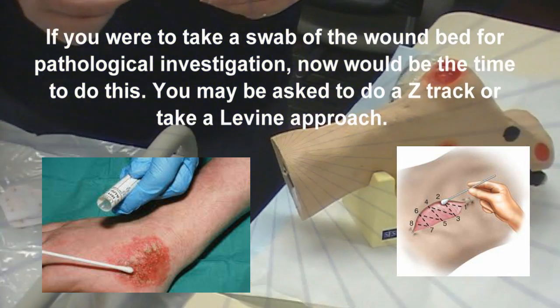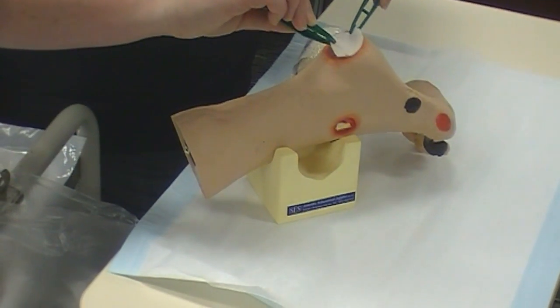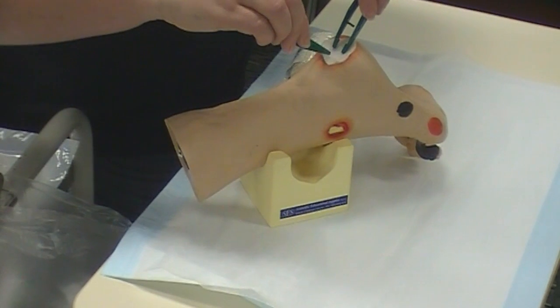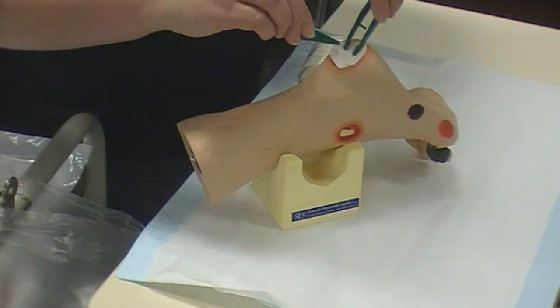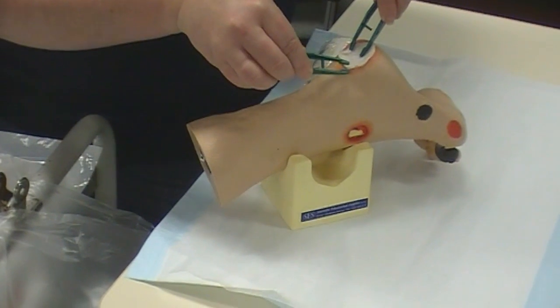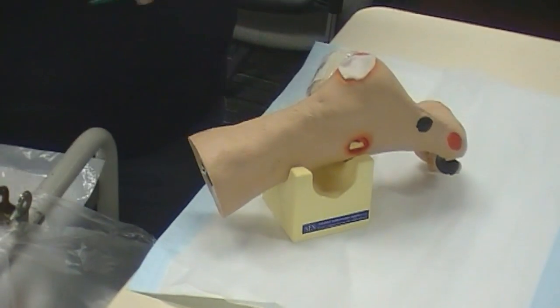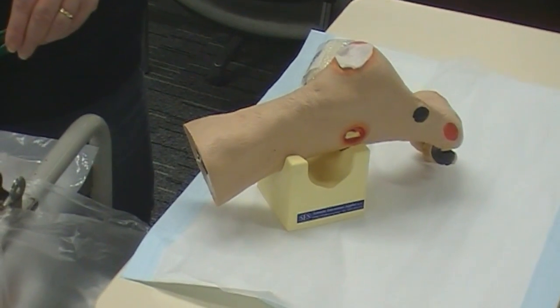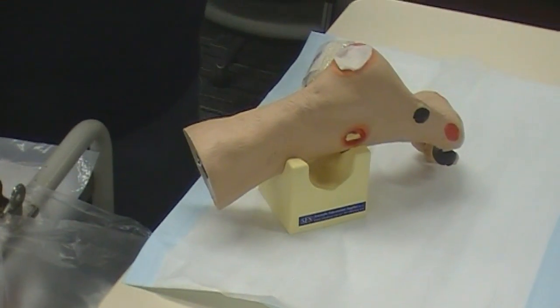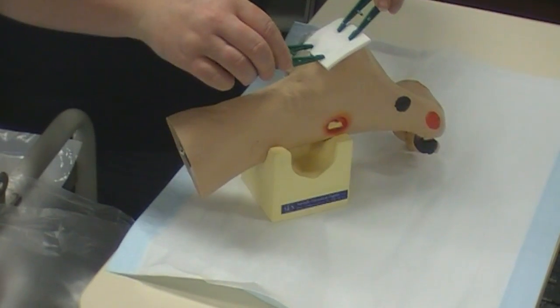First up I'll put my Dura Fiber in. This will nicely stick to the wound and the exudate. As I said, we can just fold any little bits in if we need to. The next part is our Melalin — shiny side down — and that just helps to protect and add an extra layer.